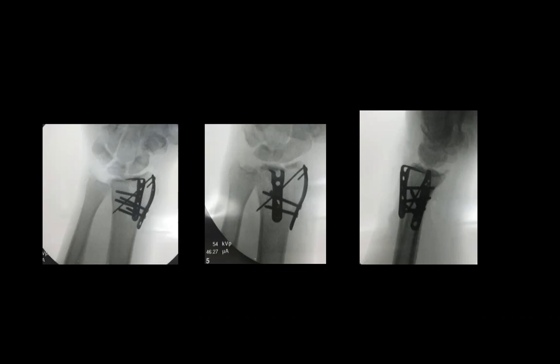I think we definitely captured it. The plate's certainly sitting where it needs to sit. You can't get any more distal with that. I think that's an awesome job. I agree. Yeah, you see on that second view how the fragment almost looks like it's slightly ulnar relative to that plate. I think they still got it.